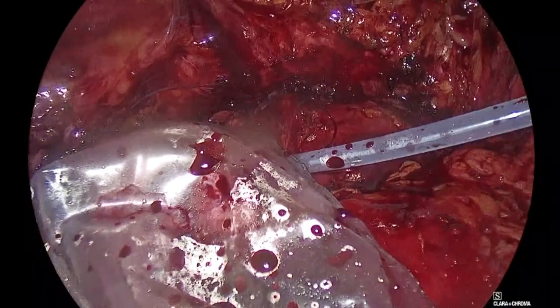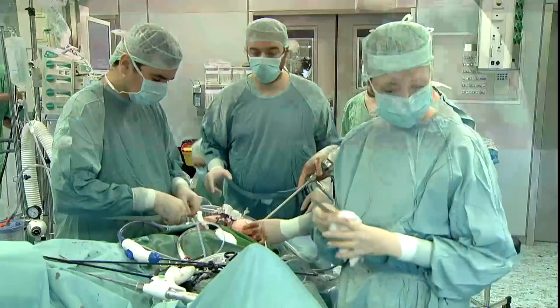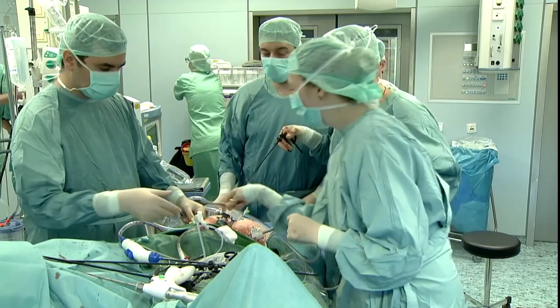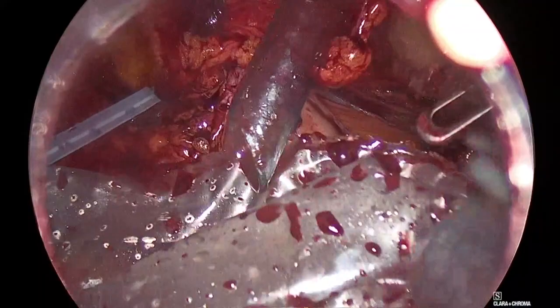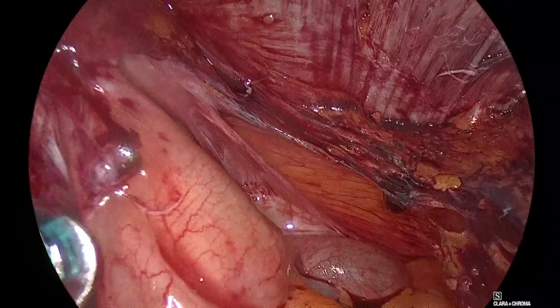Give me an atraumatic. Okay, I have it here. We move the camera now from the central trocar to the lateral trocar. Give me a strong grasper, please. Okay, we grasp the bag. Let's see where the suture of the bag is here. Good, suture of the bag is here. Look at this here. You see this? Look, the bowel is stuck up there.